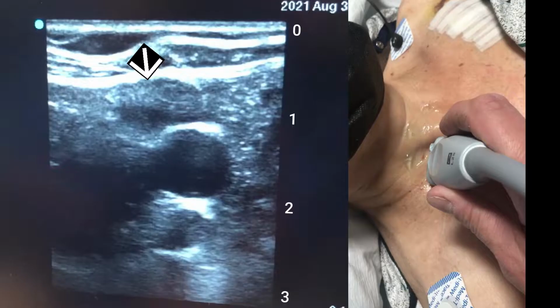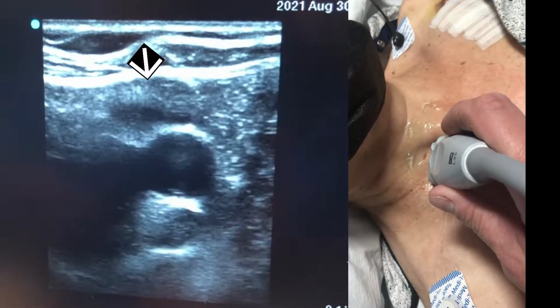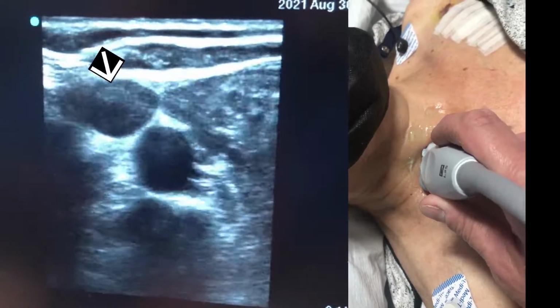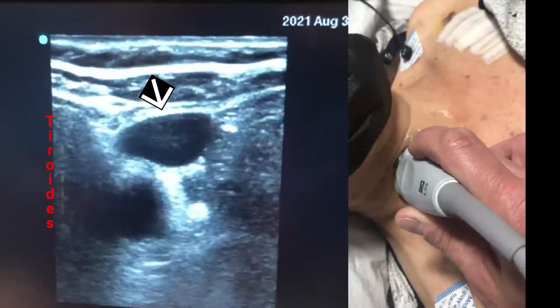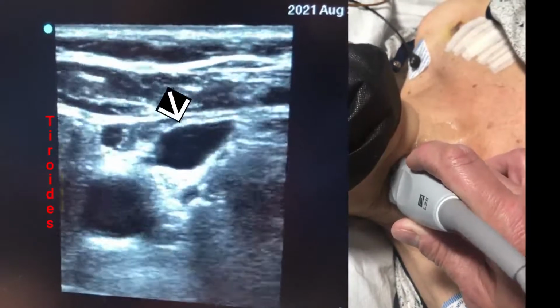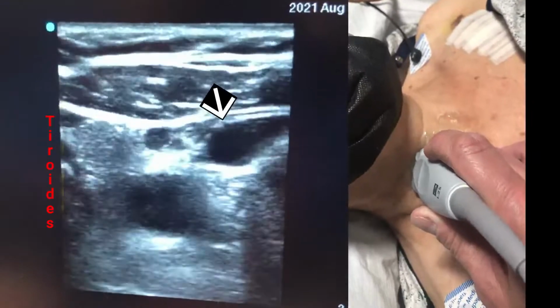So, ultrasound jugular vein assessment is a case to follow. Here we see we're scanning the neck. You see the jugular vein at the top in blue and the carotid in red, again about a centimeter in size, 8 to 10 millimeters, pretty constant in the adult. We're going to examine the whole vascular structure in the neck, moving cephalad towards the jaw, as seen in the anatomical and the patient live image on the right. We're going close to the jaw, and the arrow depicts the jugular vein. And now we're moving down towards the clavicle.